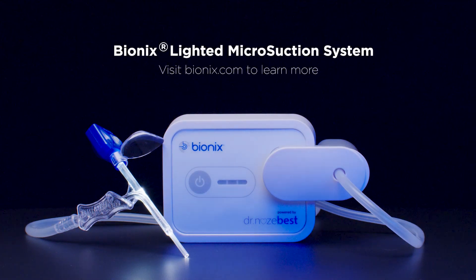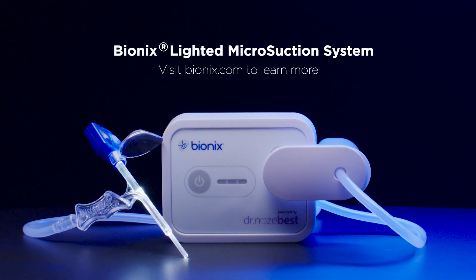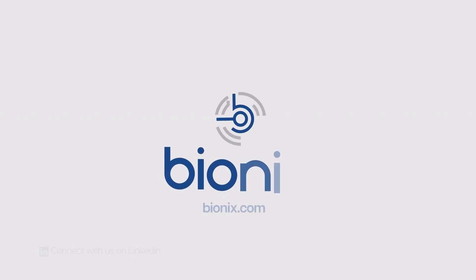Designed with clarity, comfort, and control in mind, the Bionics Lighted Microsuction System supports competent care in any setting.